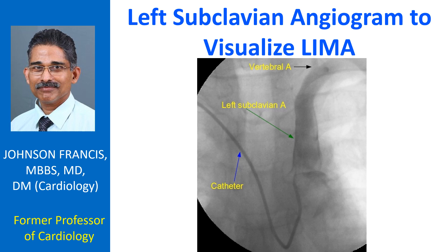Left subclavian angiogram by trans radial route using a tiger catheter. Left subclavian angiogram is usually taken towards the end of a coronary angiography procedure when multivessel disease or left main coronary artery disease requiring coronary artery bypass grafting is documented. This is in order to visualize the left internal mammary artery to be used for bypass grafting.